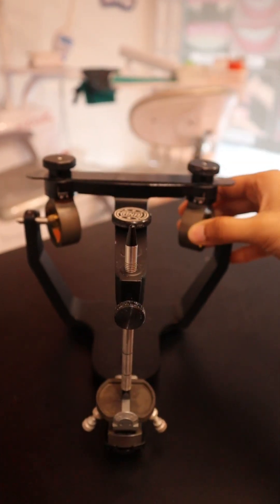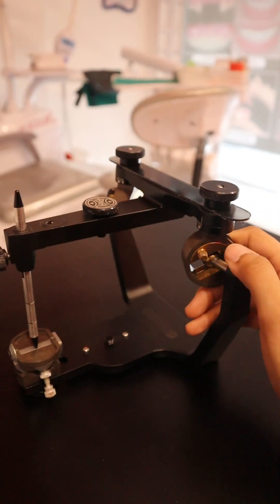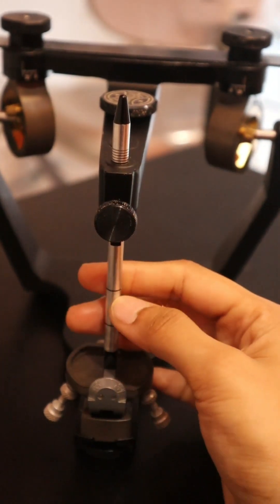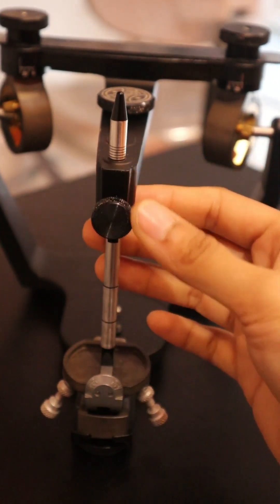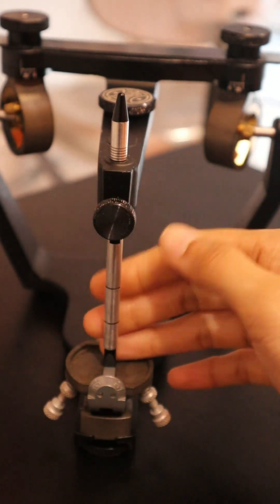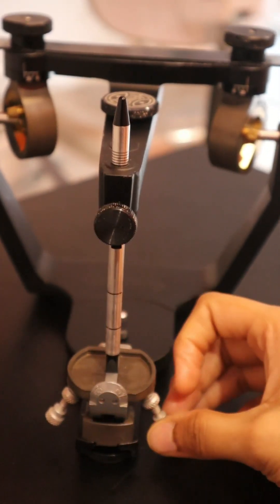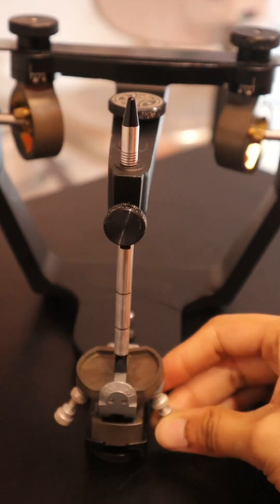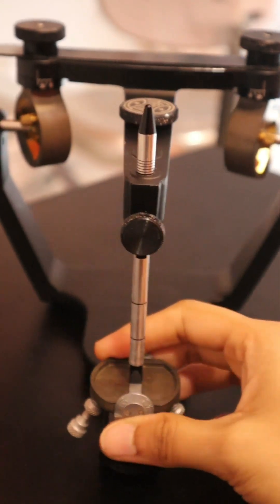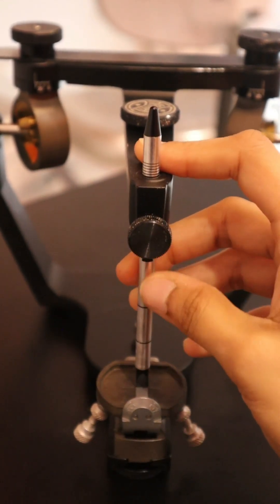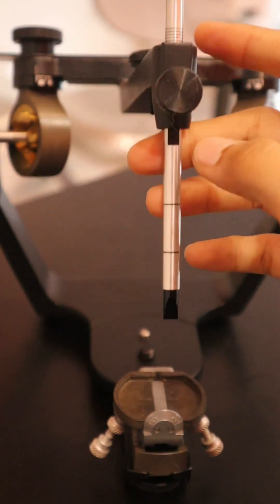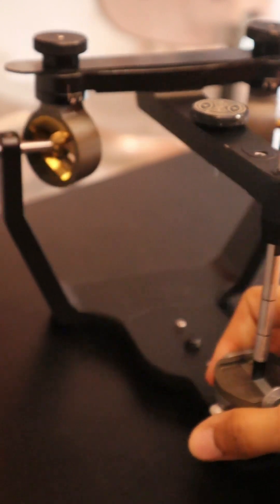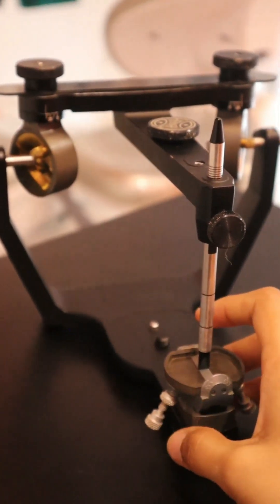As I will show you one by one, all the major parts of the articulator include the incisal pin and incisal guide table. You can see the marks on the incisal pin as well. This incisal guide table also has lateral wings which can be adjusted with these screws. You can actually adjust the lateral inclination. As you can see, I have shown you two markings—these are the actual horizontal markings from which we can take a reference for teeth arrangement.